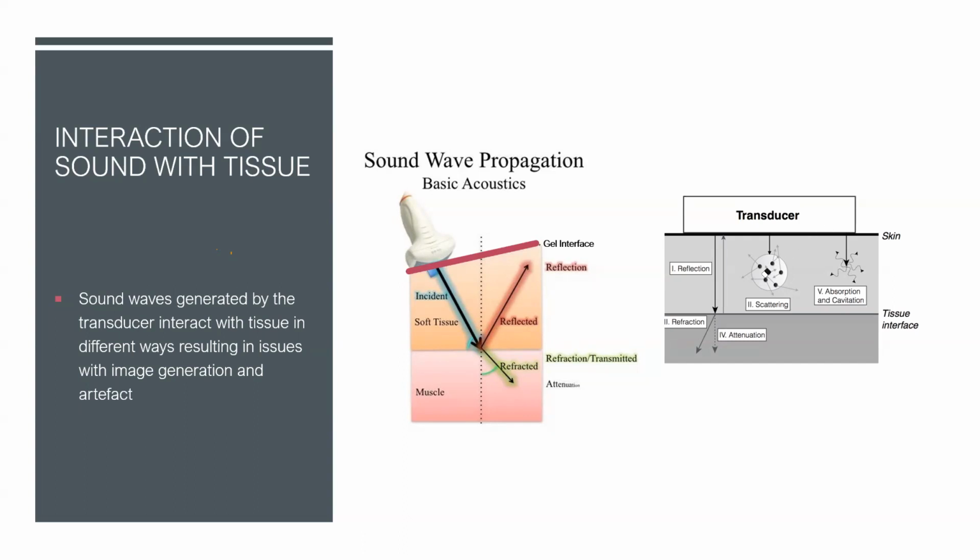Sound waves also undergo scattering, and a very good example of scattering is in brain tissue. So we know that the pleura, as you see it in the lung, is one linear shadow. I'm just giving you an analogy over here of assuming that this is pleura. It's one linear shadow. There's not much in terms of molecules in it. So incident waves tend to hit the pleura and reflect back very, very nicely. And for that reason, the pleura appears as one bright structure in the lung.